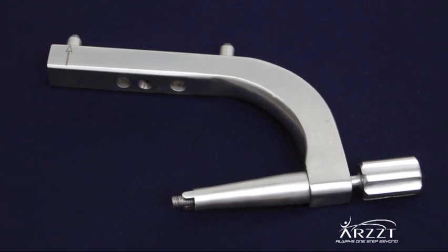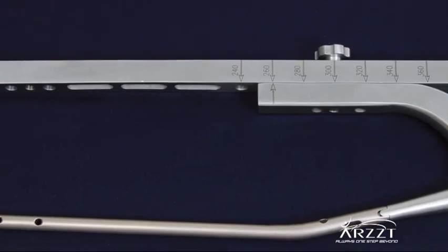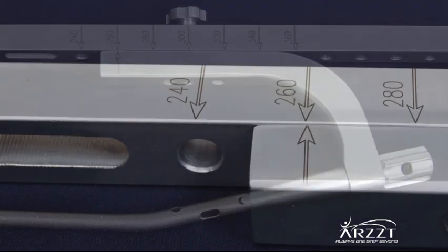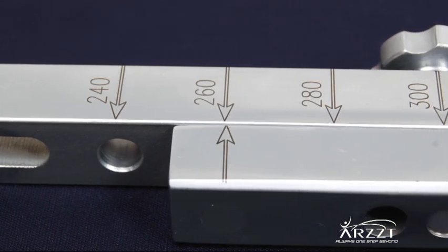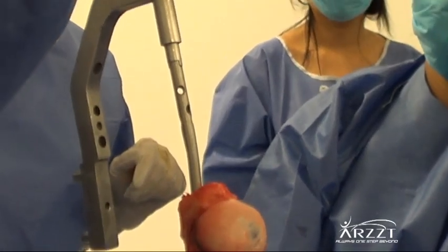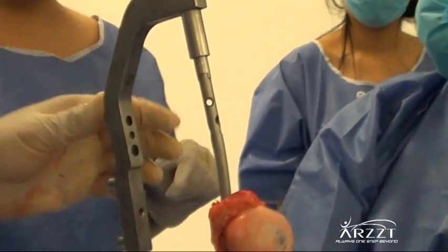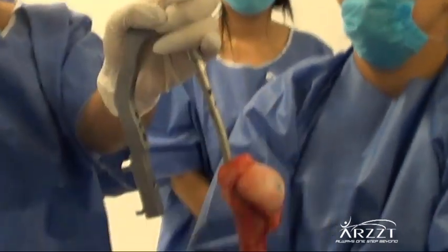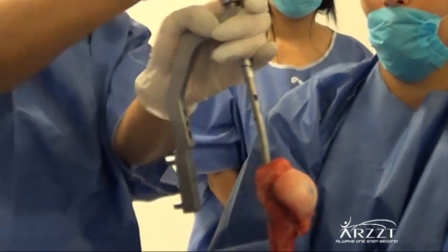The nail should be assembled and calibrated prior to use inside the humerus to corroborate the free passage of the screws and the exact symmetry with the instrument frame. Insert it firmly following the humeral shaft, guided by the image intensifier, making sure that a false path has not been created.